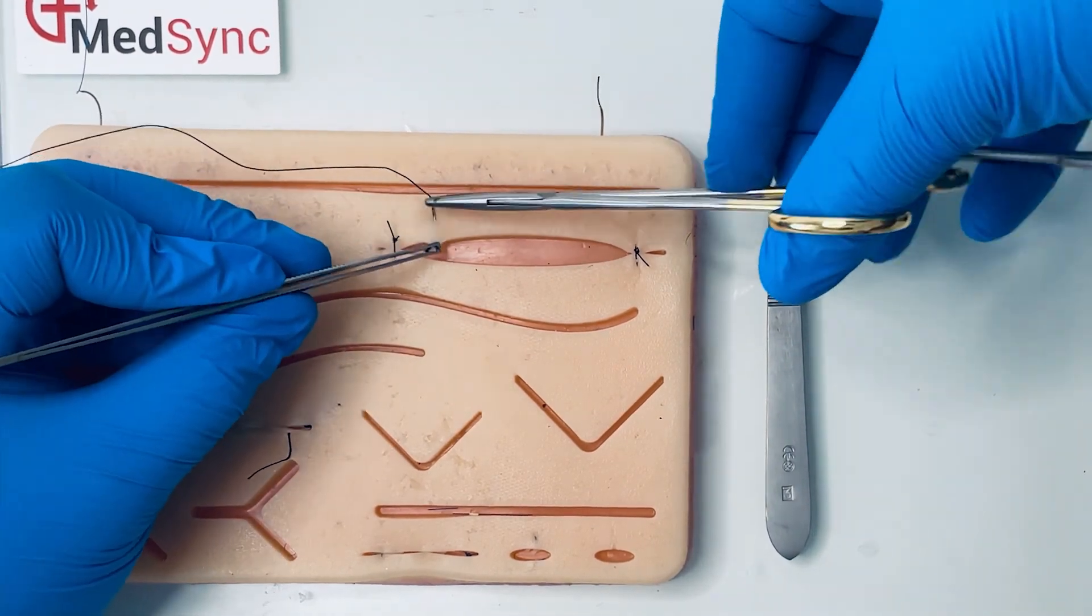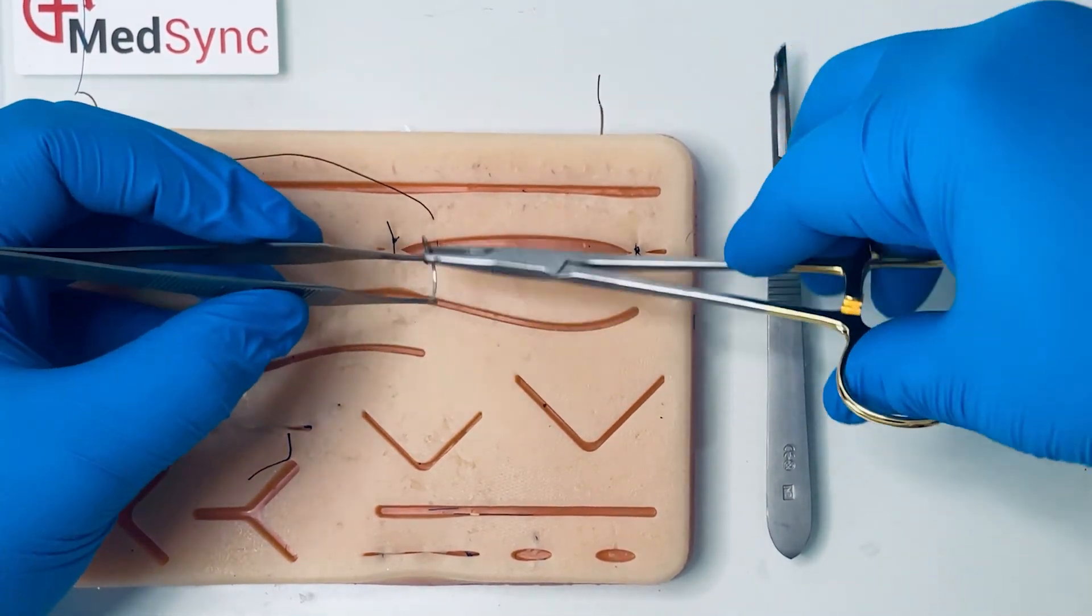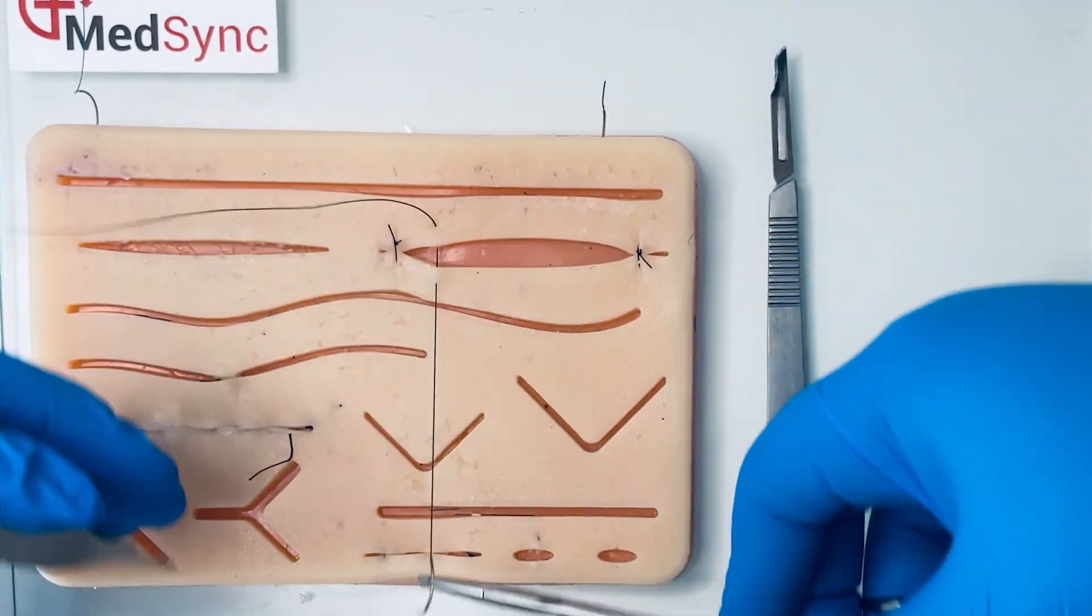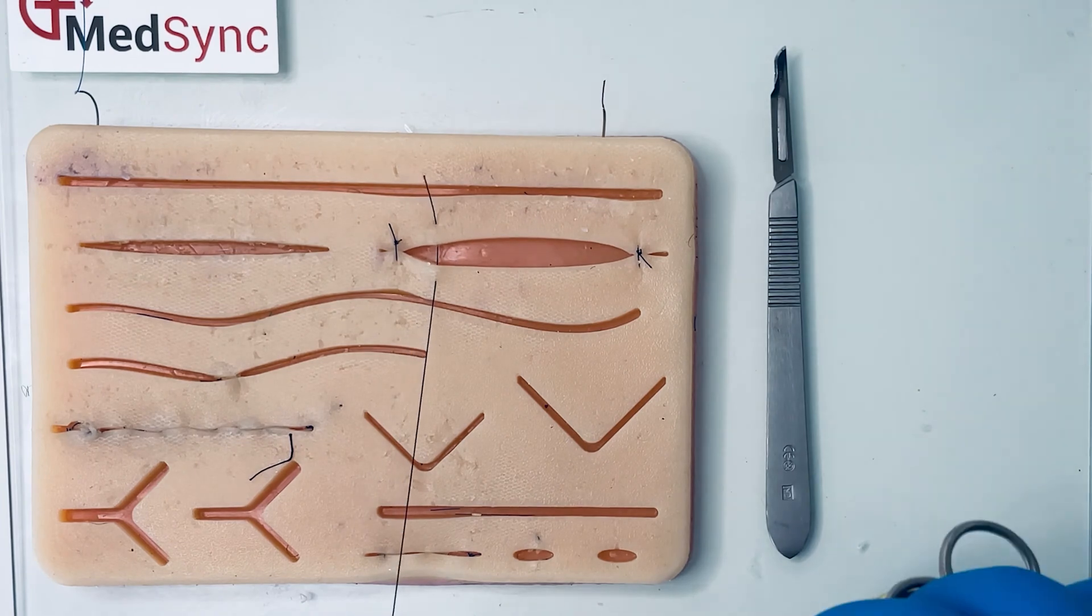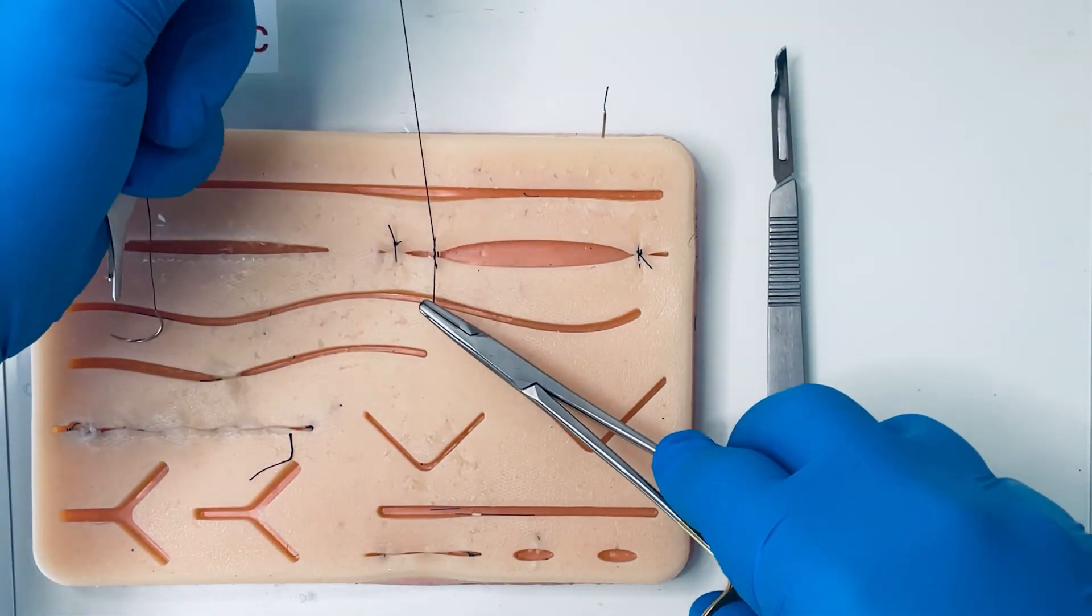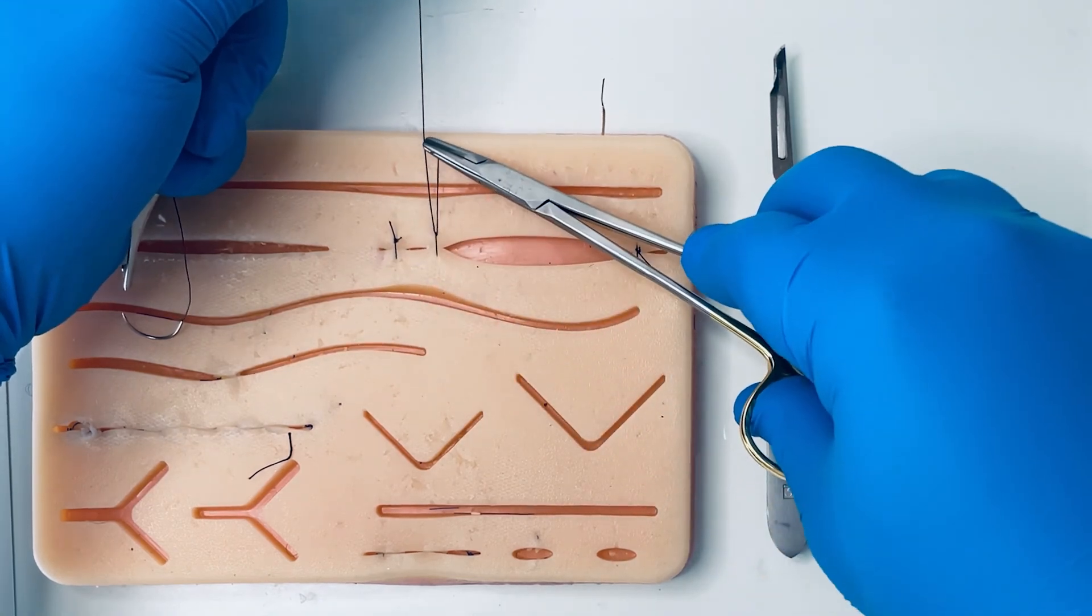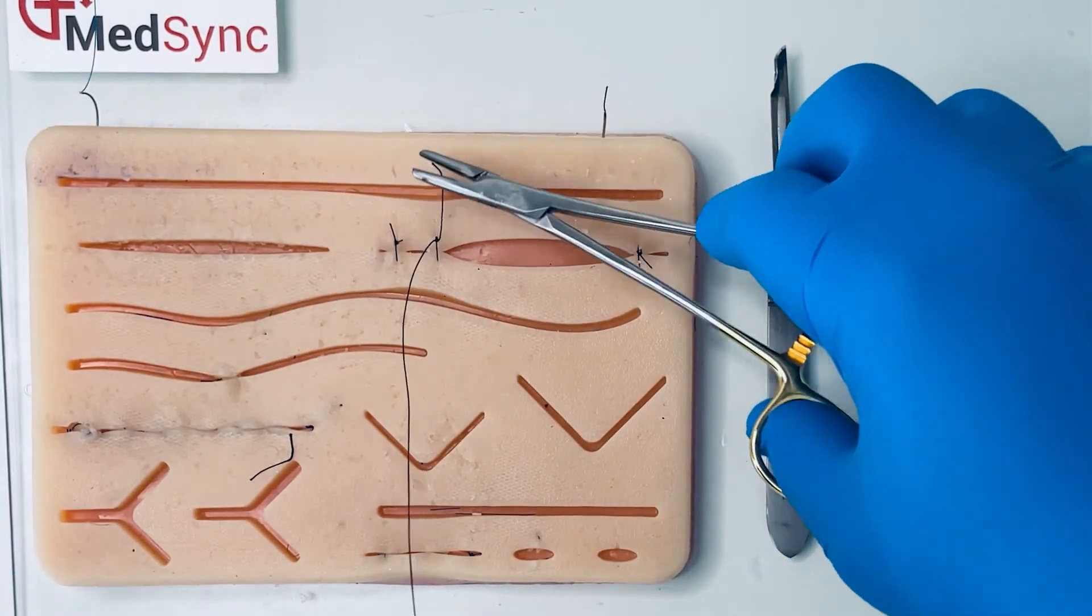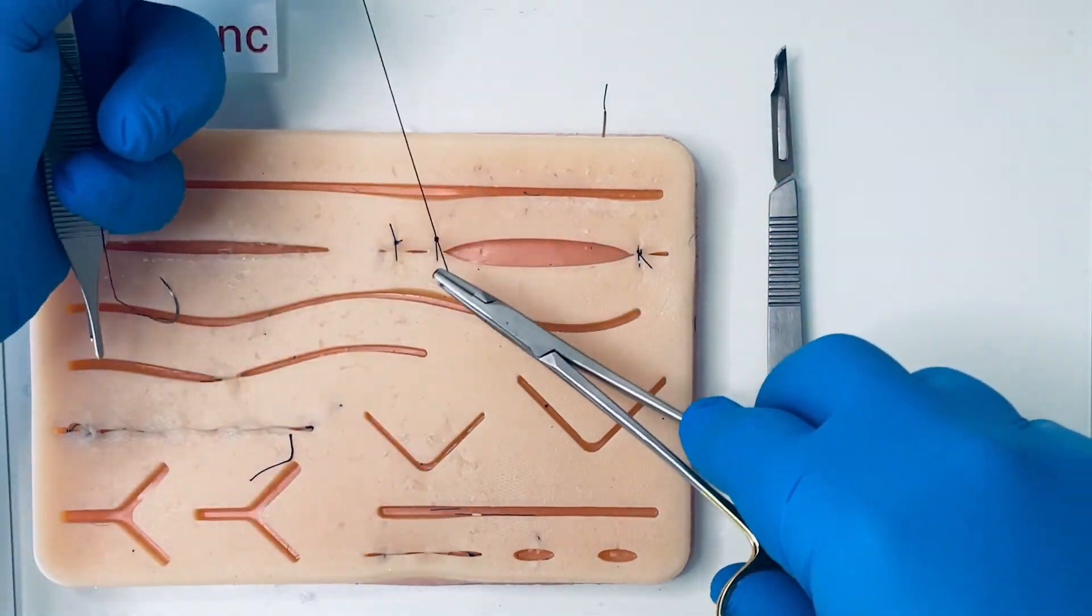In the second technique, after you lay your surgeon's knot to the correct tension, you keep the long thread taut and you slide the short thread over to the same side as the long thread. The knot will hold. You continue laying square knots, alternating your throws.